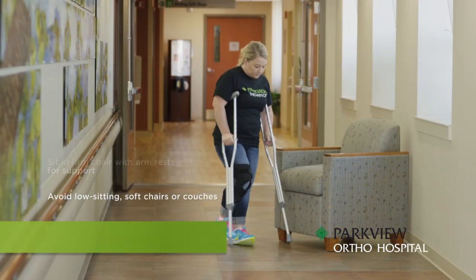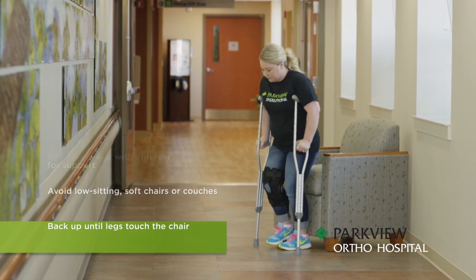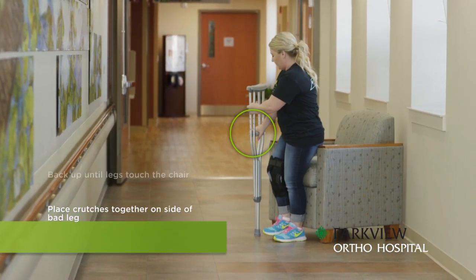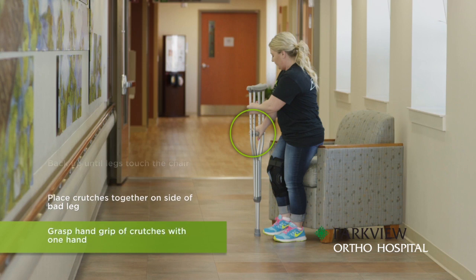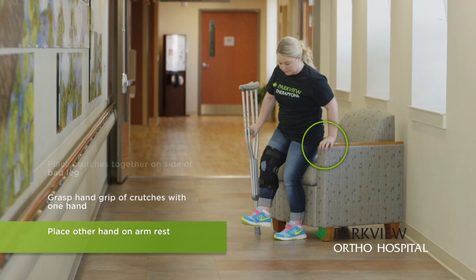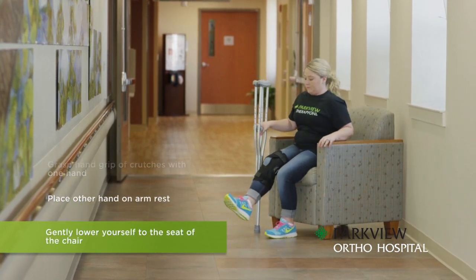To sit down, back up until your legs touch the chair. Place both crutches together on the side of your bad leg, grasping the hand grips of your crutches with one hand. Keeping your bad leg off the floor at all times, place your other hand on the armrest and gently lower yourself to the seat of the chair.